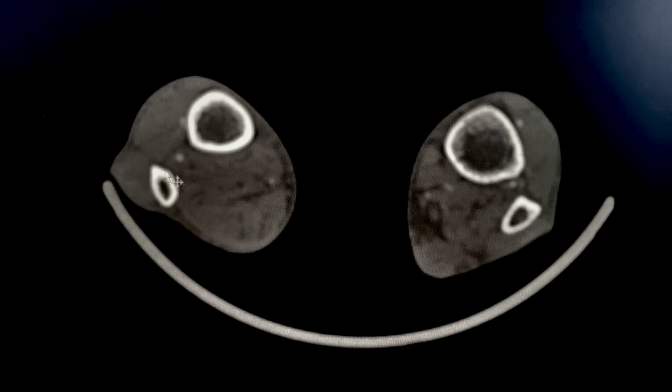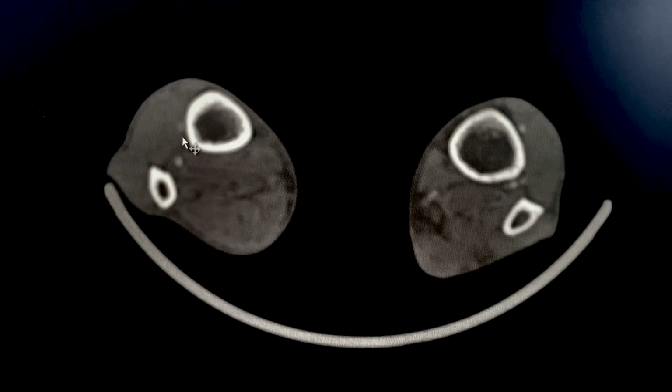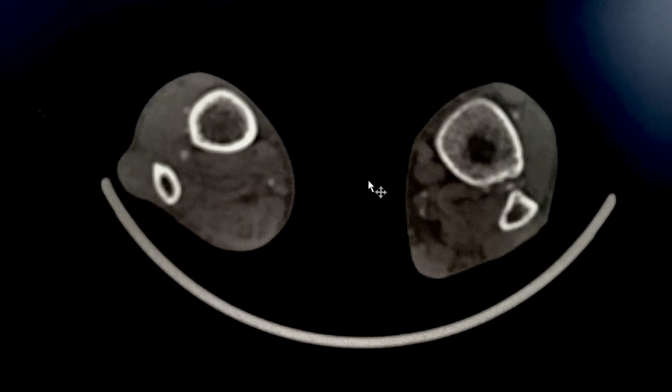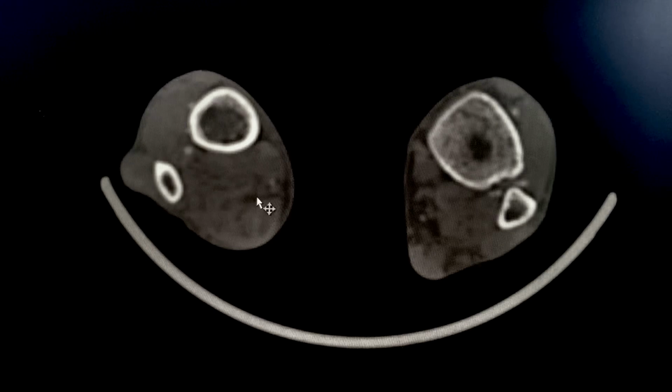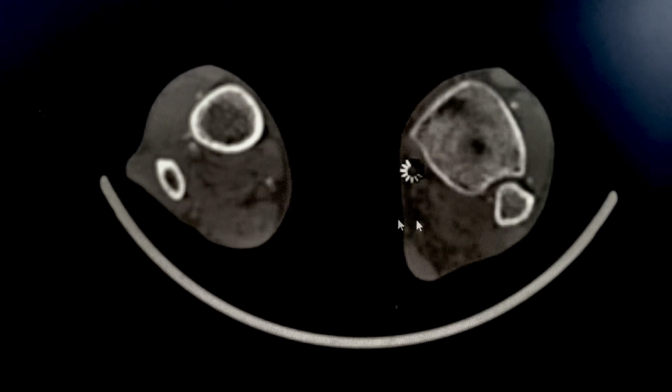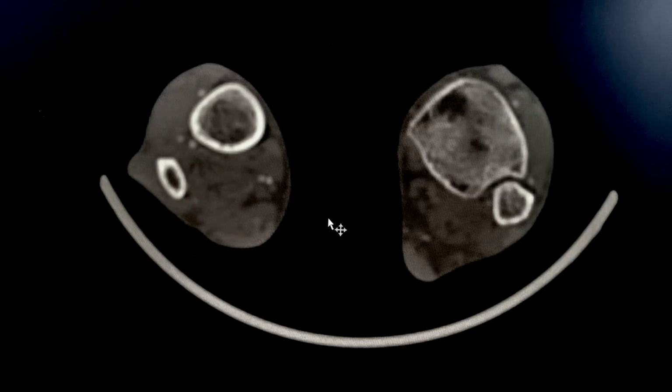On the right side, you can see the peroneal artery continues unoccluded, whereas the anterior also regains some collateral contrasting here. And the posterior tibial here keeps receiving and going off, as well as here on the right, the posterior tibial also keeps receiving some collateral contrast.